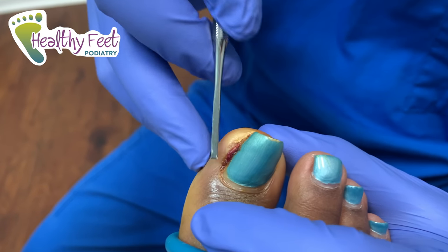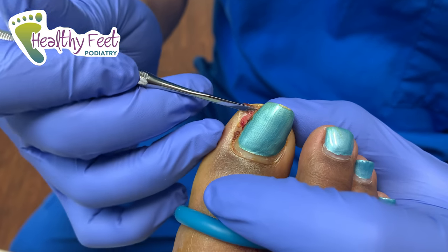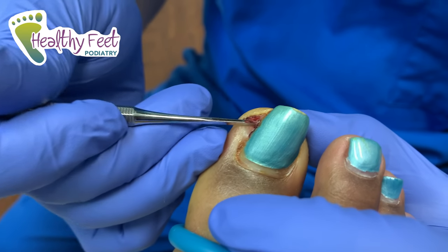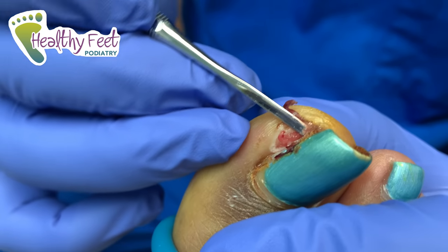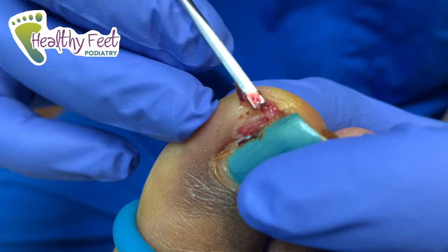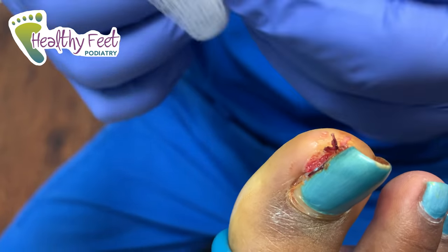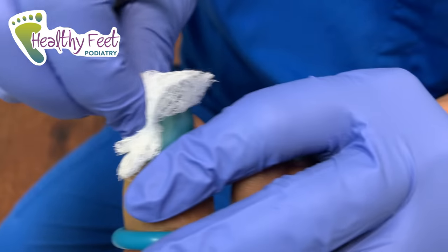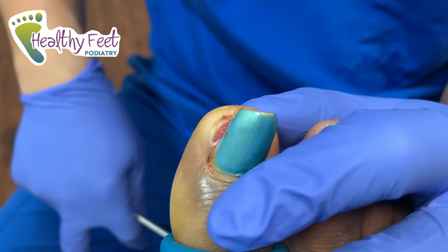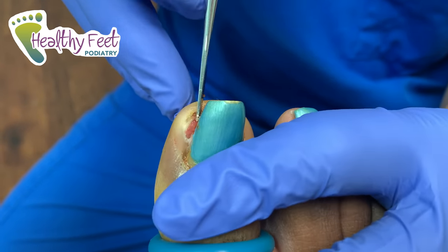So first things first, we're going to get this crud out of the area. She said there was a bunch of pus earlier this week and we might get some today. Are you numb yet? Here you go — a little pus right there, a little pocket of pus. Did you say mmm? Mmm, pus. Delicious. Lunch. I got some on my pants — I normally don't wash them, but now I gotta.